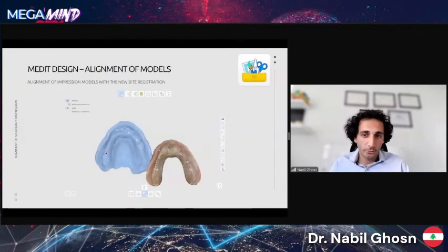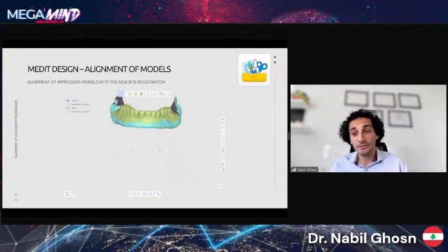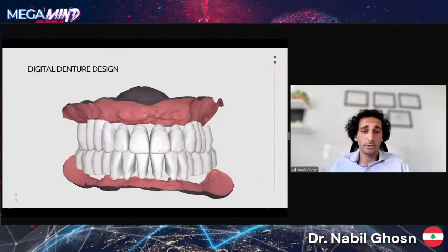models. Those models were aligned to the models from the new bite registration, and like this, we achieved a digital setup with the adjusted vertical dimensions. So this new setup will be used in order to do the teeth setup for the new denture design.